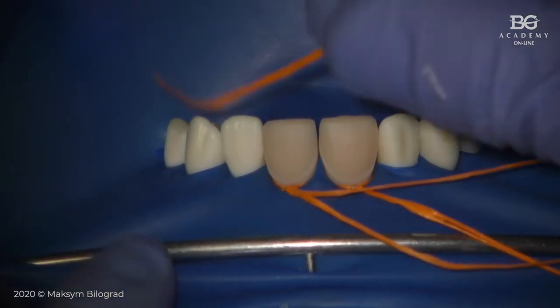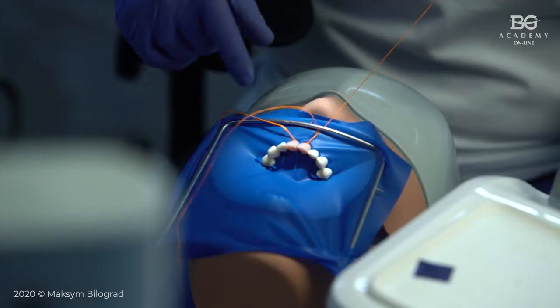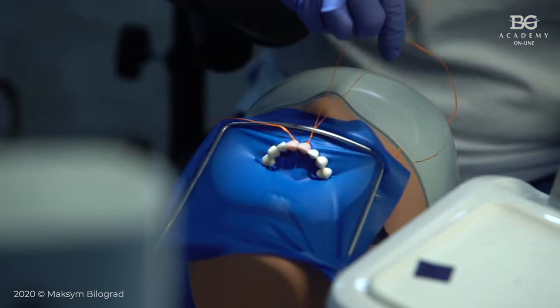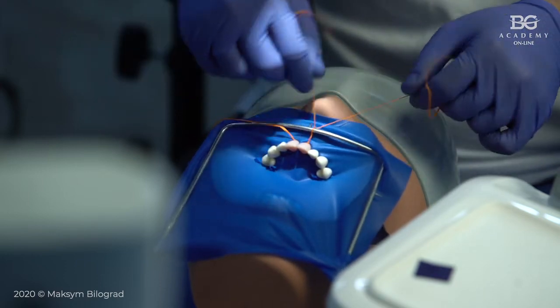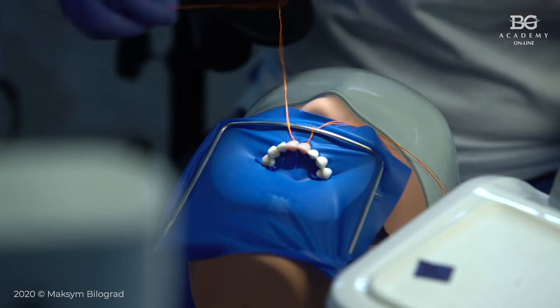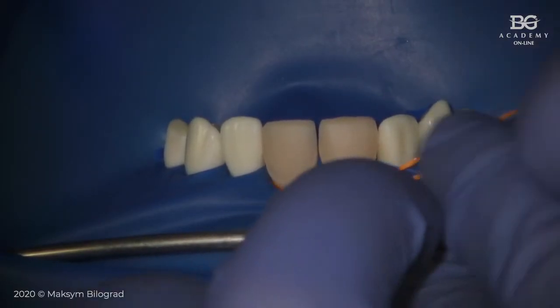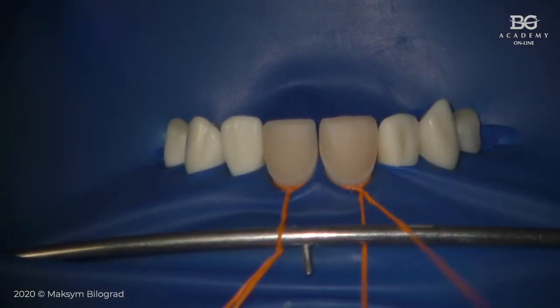You will put your floss underneath like this. Okay, and then you will make a simple knot here, first one, and then second one. So you will get your floss tightened to the frame, and you will have more exposure, or let's say you will have more retraction of rubber dam and soft tissues by floss tightened to the frame. This is the trick. I will do it on both teeth.